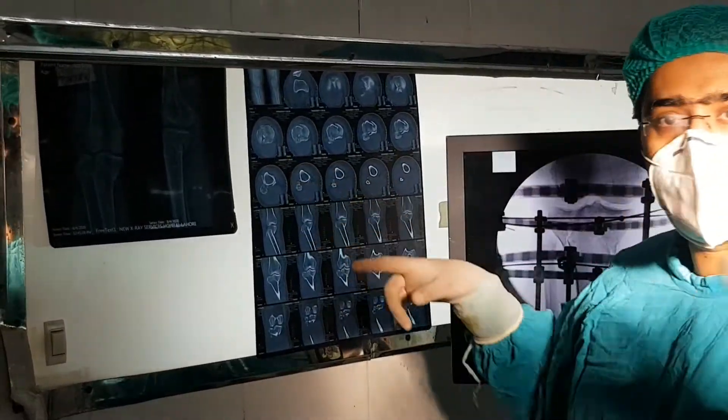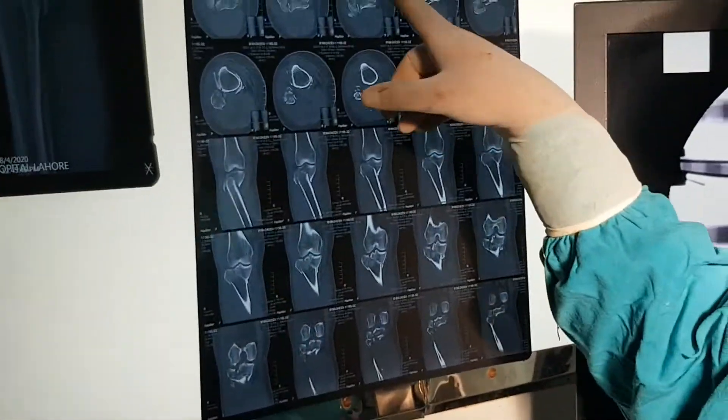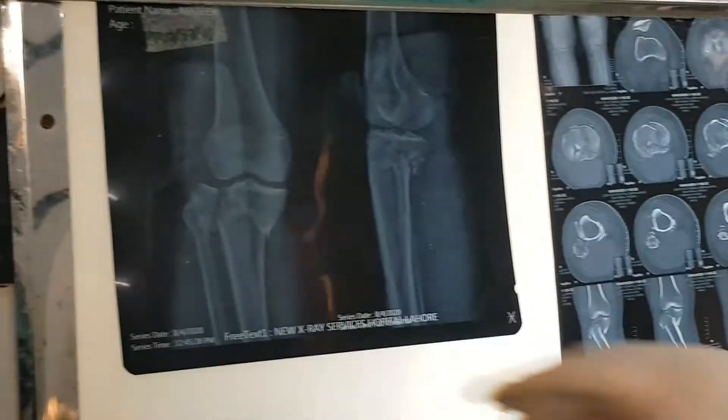You can see the CT scan. If our cameraman can come closer, I want to show how much comminution was in this fracture. This is the axial plane, and this is the coronal plane. These are the X-rays as well.